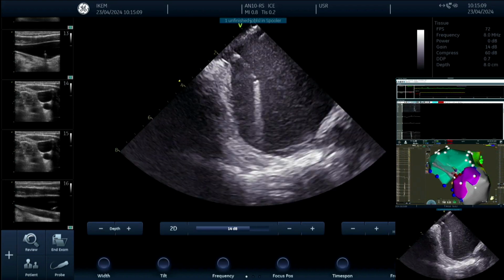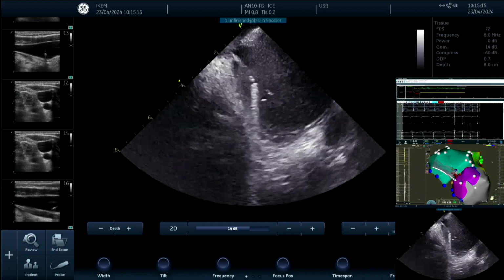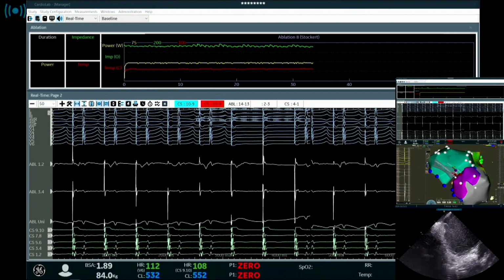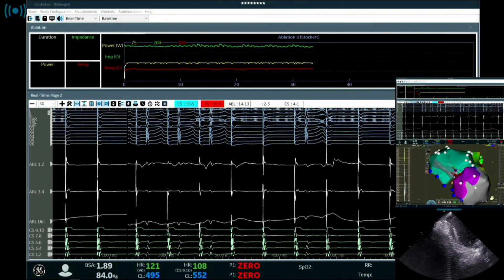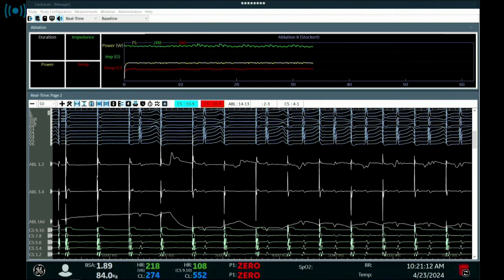Yeah, this was a good comment, and I think we repeated that several times during this meeting, that intracardiac echo really gives you power to display what you want to display, to do things that you otherwise do just by chance. And here you can do selective puncture. You want to do low puncture, high puncture, anterior, posterior, so you can really be selective.